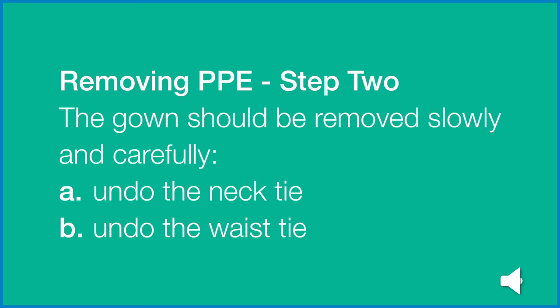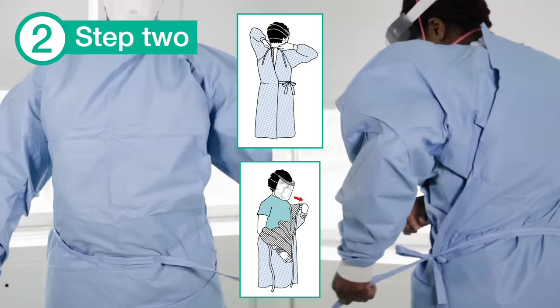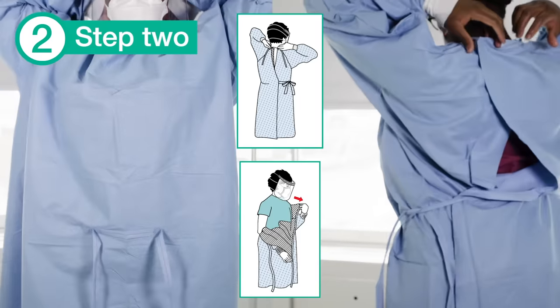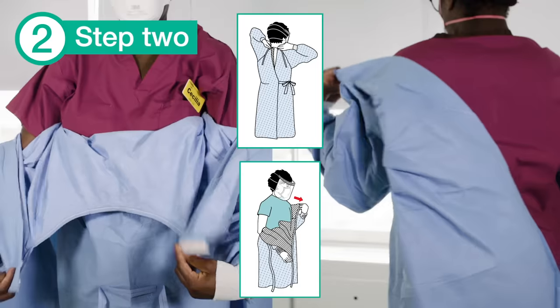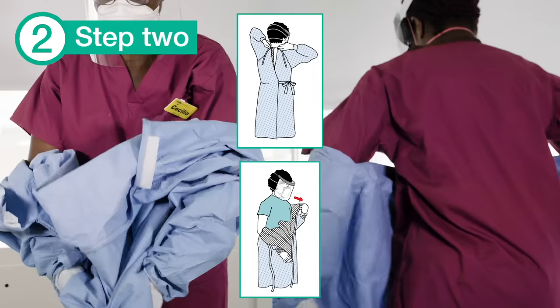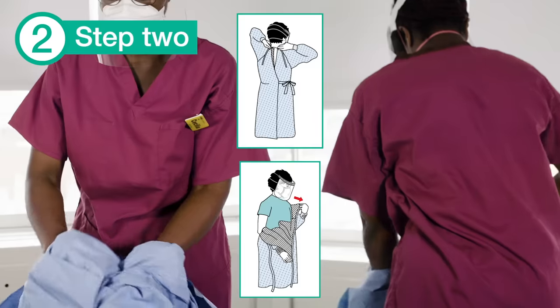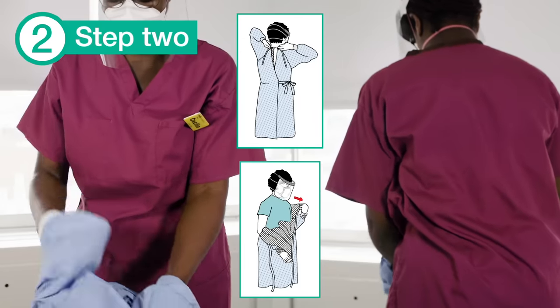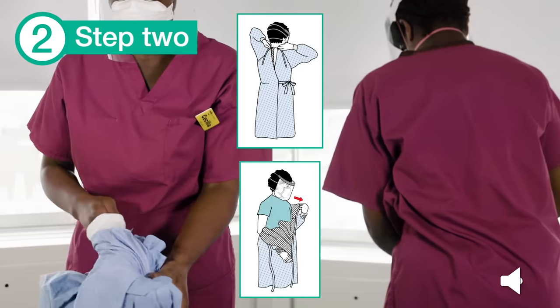The gown should be removed slowly and carefully. Finally, turn the gown inside out, fold or roll into a bundle and discard into the waste bin.